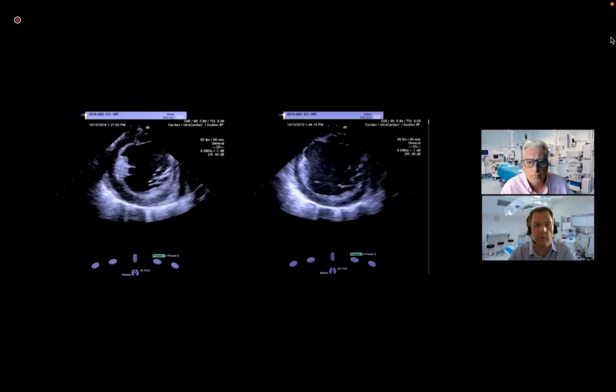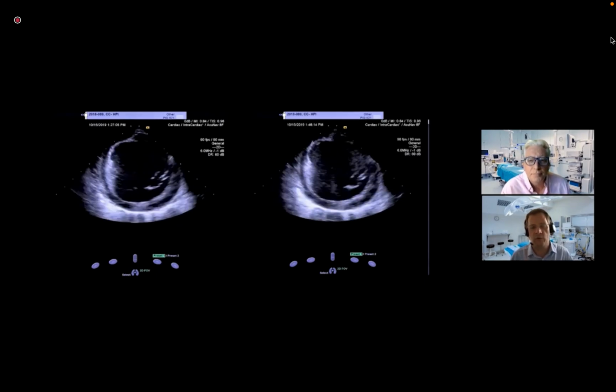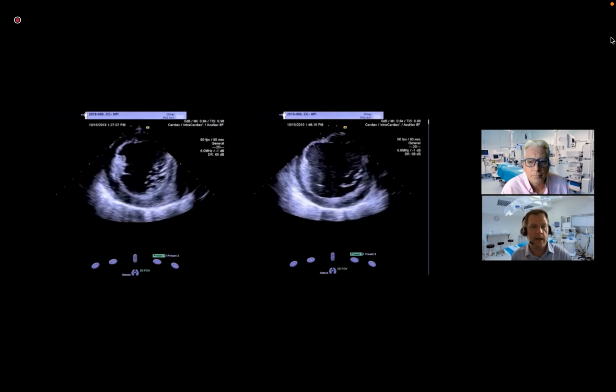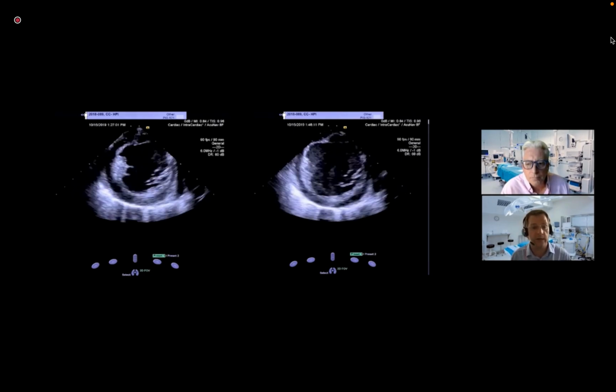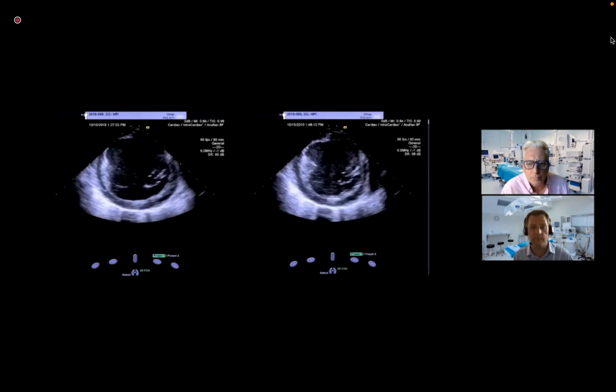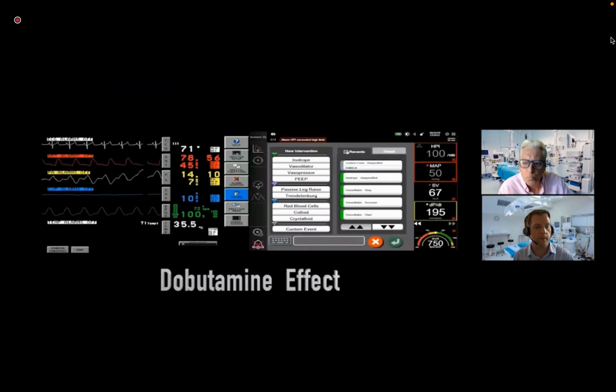So it seems to reinforce, if we put things side by side, that the drop in DP/DT is reflected by echocardiographic changes when we view the heart as well. Great, very neat. Super.